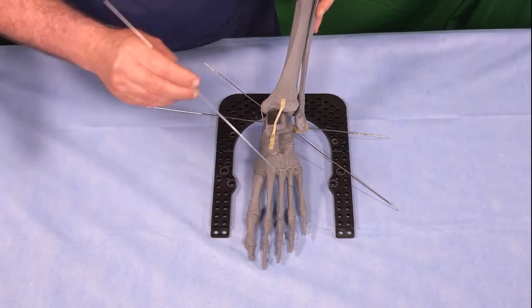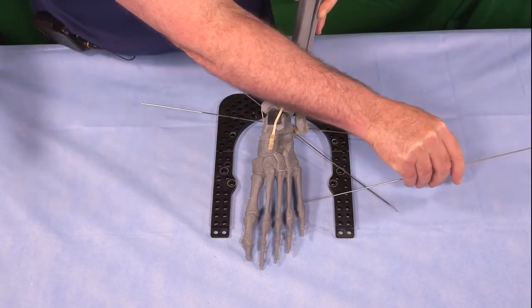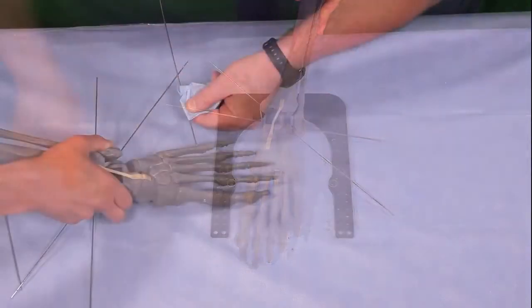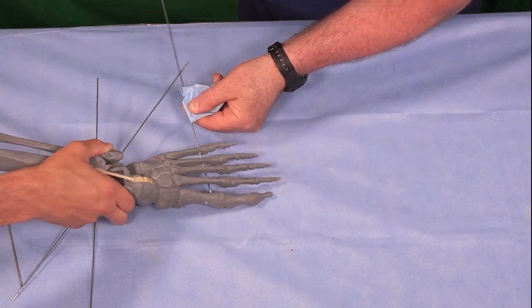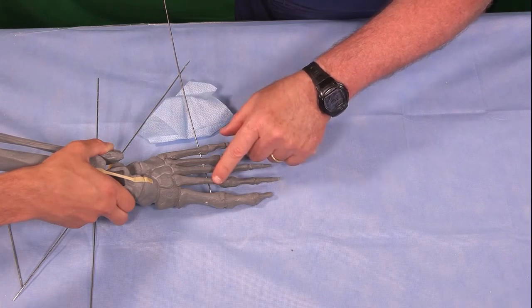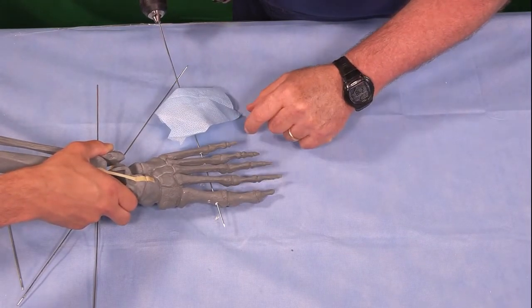The principle here is that you go from a small target to a big target. If I start my wire on the first metatarsal, I may or may not hit the fifth. If I start my wire on the fifth metatarsal, it's easier to hit that big target of the first metatarsal. I'm going to start my metatarsal wire in metatarsal number 5 and aim for the distal part of metatarsal number 1. I've just hit number 1. I went underneath number 3 and underneath number 2. That's okay because there is a transverse arch. It's important here to make sure you're not in the joint. We don't want an interarticular wire.